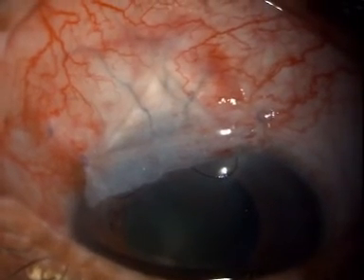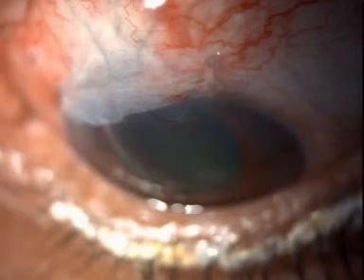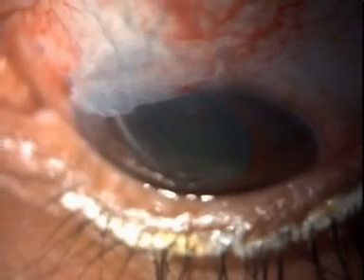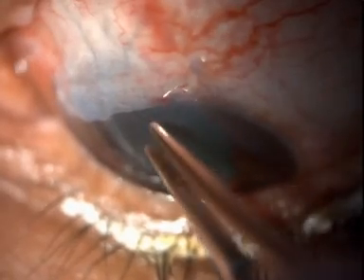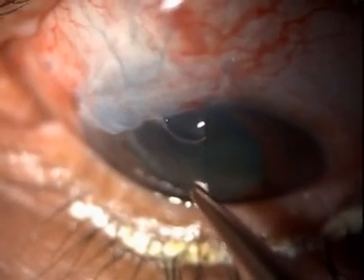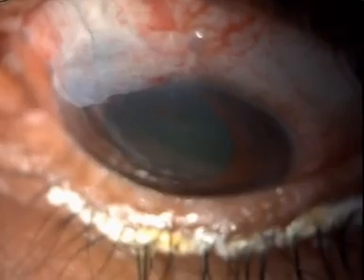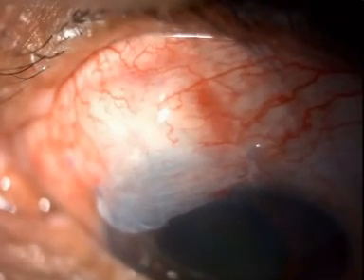Suture release postoperatively can be done from day 1 to 1.5 months, after which fibrosis results and the suture breaks while attempting its removal. Suture release can be done by holding the corneal loop with suture removal forceps and gently pulling it down. The bleb is raised by gentle massage.